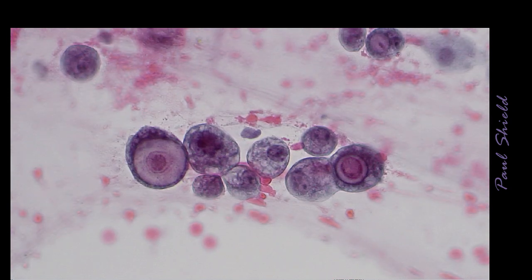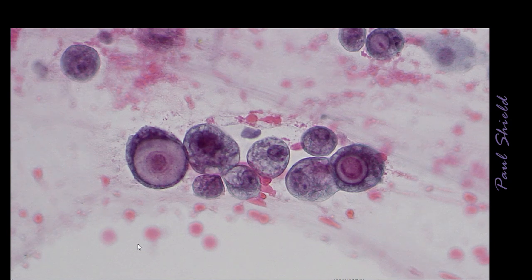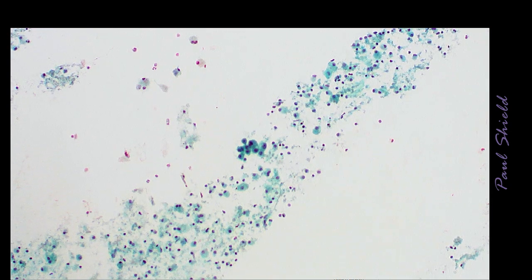This case also has a lot of single cells, and you can see they have that classic targetoid vacuole. This one has like a signet ring appearance to it with the nucleus pushed to one side by the large vacuole. And notice they look a bit histiocytic. So that can be a problem.